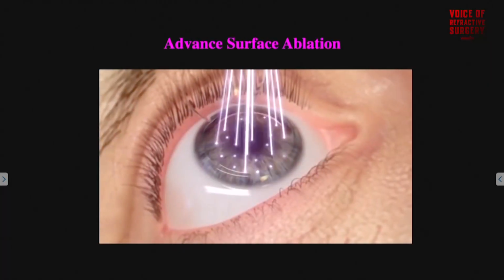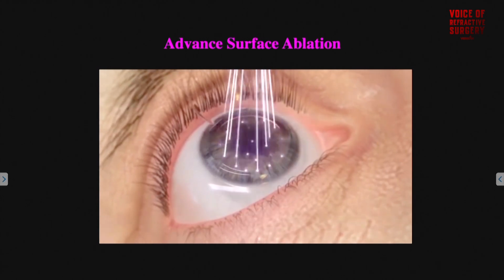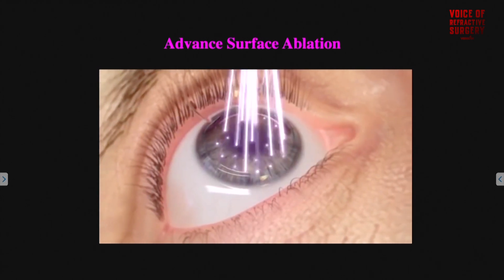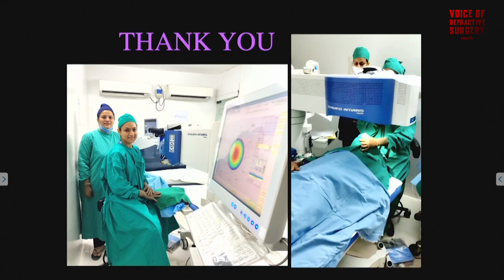So when we have catered to all these points, why not give our patients the benefit of surface ablation and not just limit it to only suspicious corneas or where we think that a flap would not be the ideal option. I cannot stress enough, before ending, that good patient selection goes a long way. Low to moderate myopia, patients with lesser astigmatism and mild dry eye do very well with surface ablation as compared to hyperopes, high ablations, or patients with chronic allergies or chronic contact lens users, where the chances of inflammation are more.